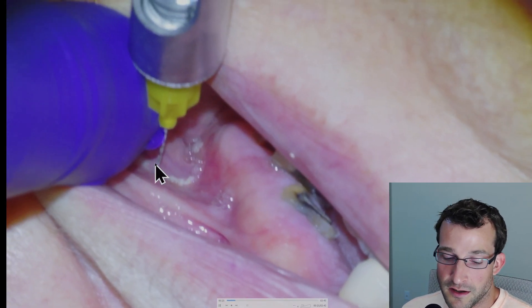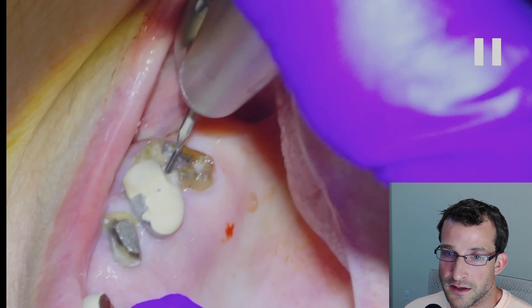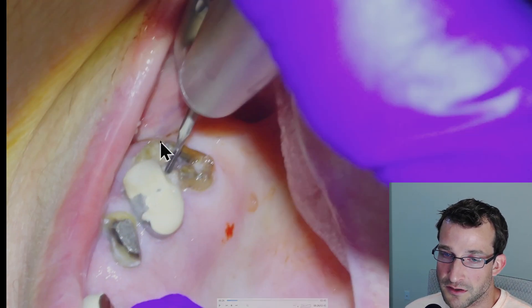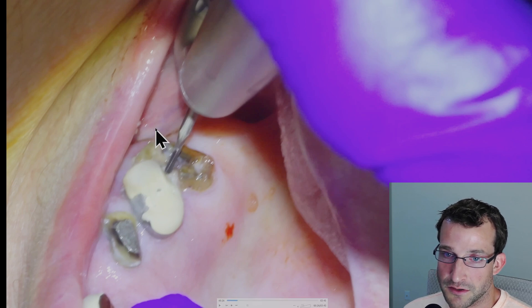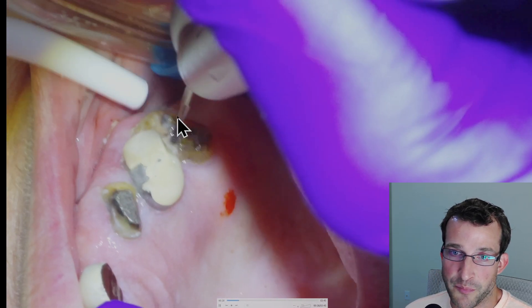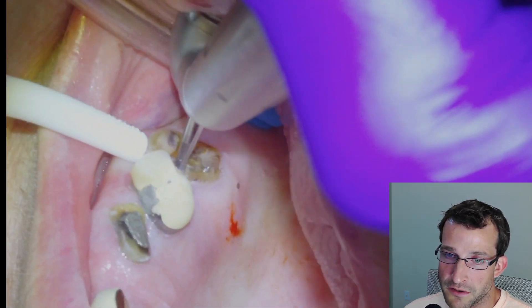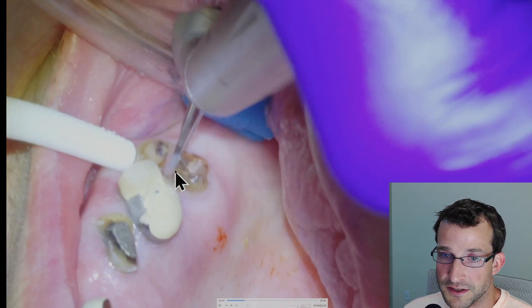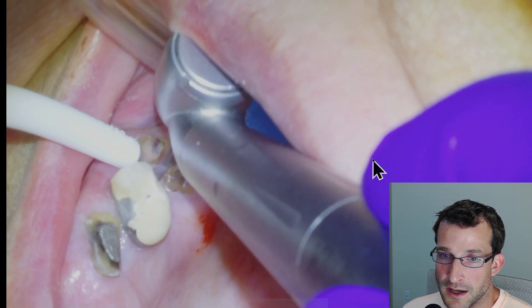So we're going to infiltrate the area on the buccal and the lingual and then get to work on the tooth. This is not the type of situation that you can grab with a forcep, so we know it's going to be surgical. You can lay a flap and remove buccal bone, but we're just going to try to get it out without a flap. We're basically just going to section the buccal roots from the palatal root.